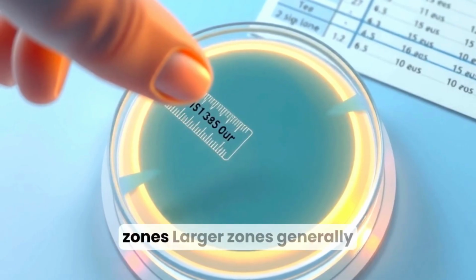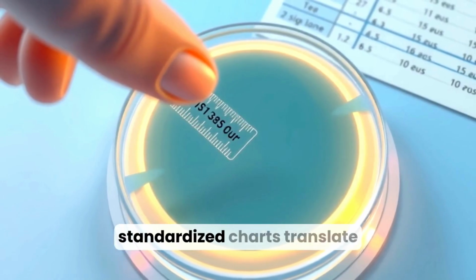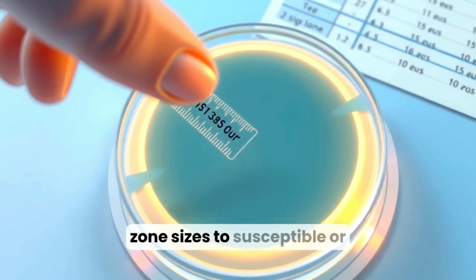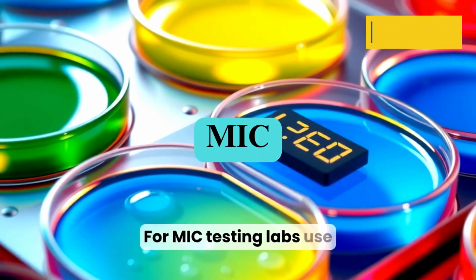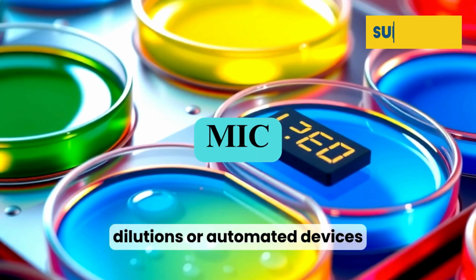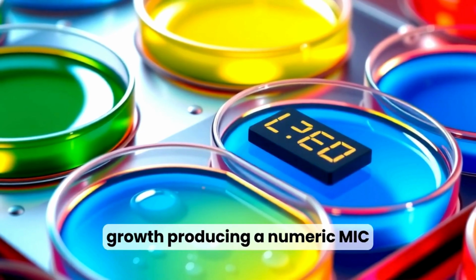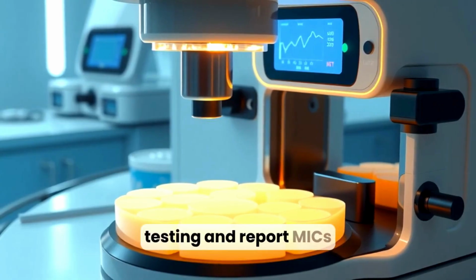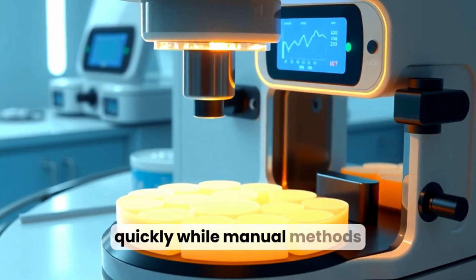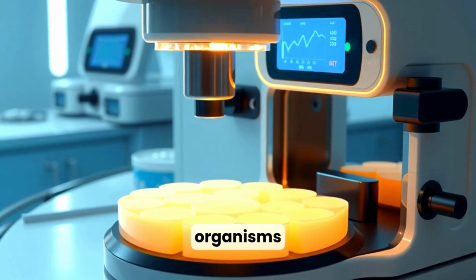Technicians measure these zones. Larger zones generally mean greater sensitivity, but standardized charts translate zone sizes to susceptible or resistant calls. For MIC testing, labs use dilutions or automated devices to find the exact concentration that prevents growth, producing a numeric MIC value. Automated systems can speed testing and report MICs quickly, while manual methods remain important in many labs for confirmation in unusual organisms.